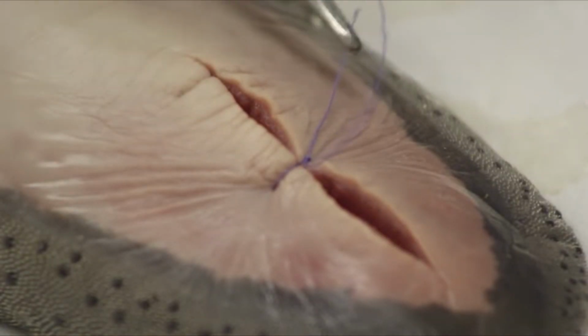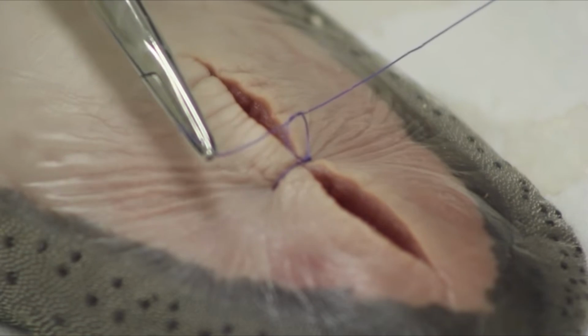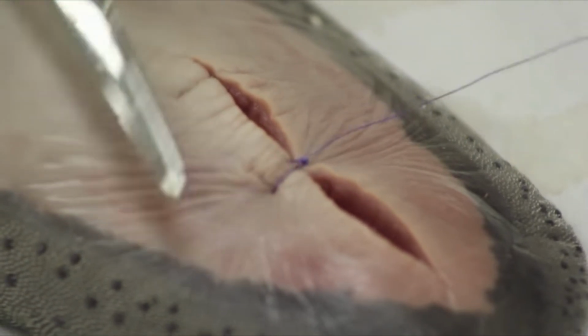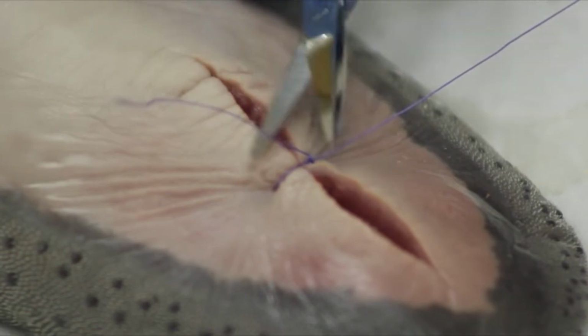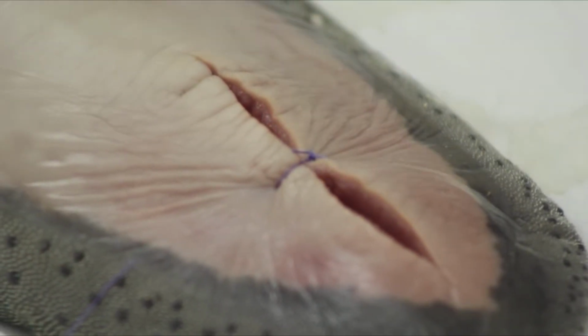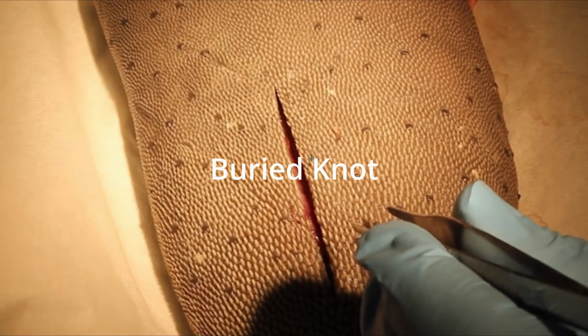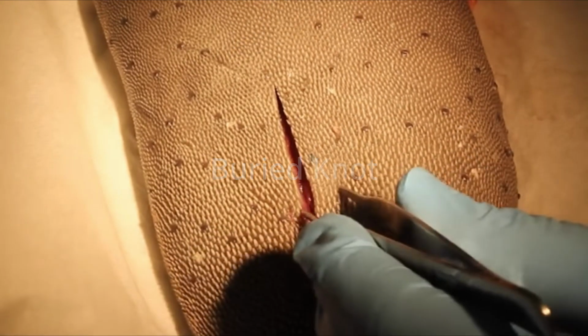Trim the tails to an appropriate length. The finished stitch should show gentle eversion, the knot sitting to one side of the incision line, and clean edge alignment. Next, this same needle angle and bite symmetry will be applied to buried dermal stitches and other tension managing patterns. Next up is the buried knot dermal stitch, also called an inverted simple interrupted.